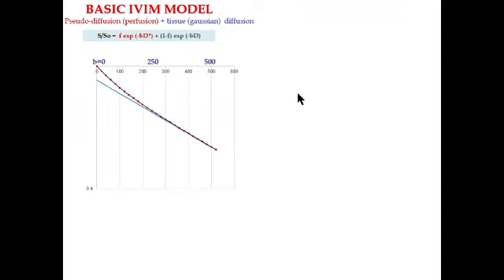So how do we separate diffusion from perfusion now? From this curve, we can see that if we calculate the ADC, the apparent diffusion coefficient, as a log of the signal attenuation, we get different values depending on where we are. If we use high b values, for instance, between 200 and 500, the IVIM effect is gone. We don't see it. It's completely crushed. So then we have the ADC, which is diffusion.